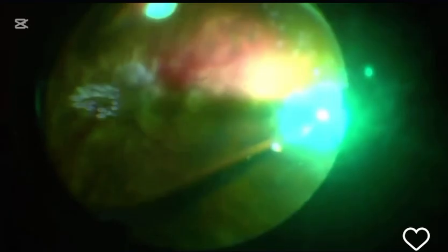So it's a large globe, so you have to rotate the globe in order to reach the other side with indentation that helps. The visualization system is something more challenging for every future vitreoretinal surgeon. So getting the visualization and the agility and the mobility all around with the illumination is something that takes time to be adjusted to and get used to.